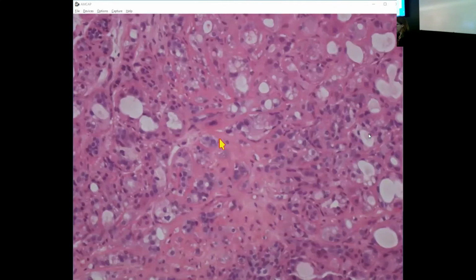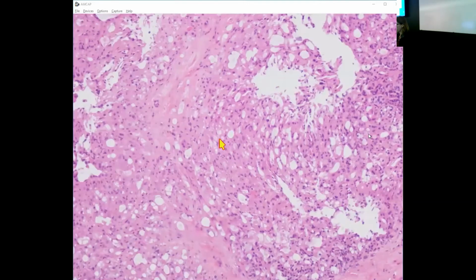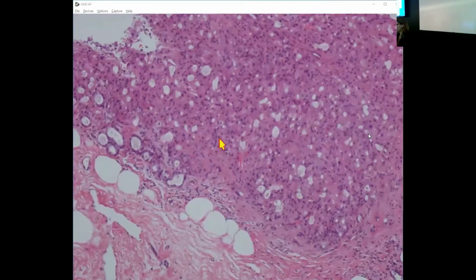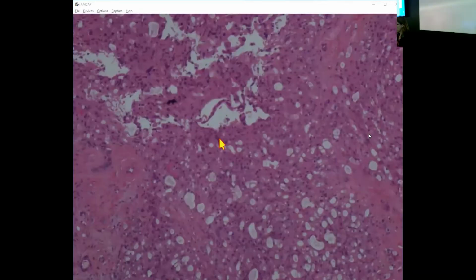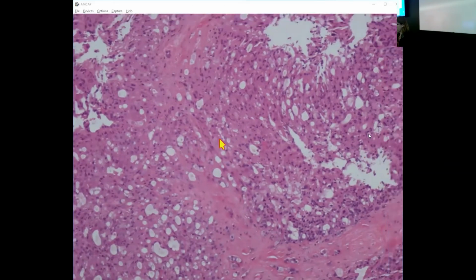So I'll tell you, does anybody have a carcinoma differential diagnosis for this? Does it remind anybody of anything particular? Yeah. So actually, that's how it came in. Somebody was questioning whether it was secretory carcinoma. And I think that's a reasonable question, right? Because secretory carcinomas can be lobulated, microcystic, and very pink.